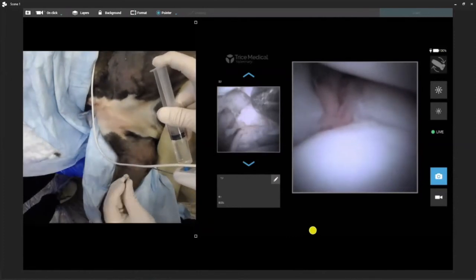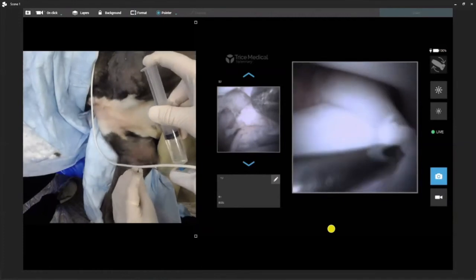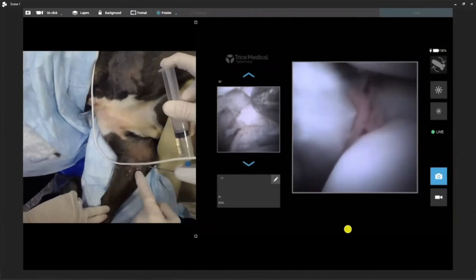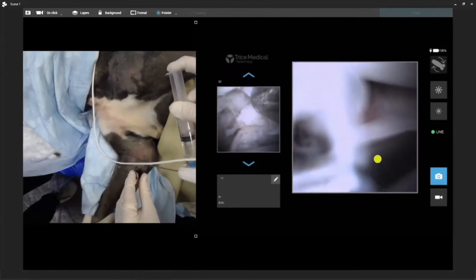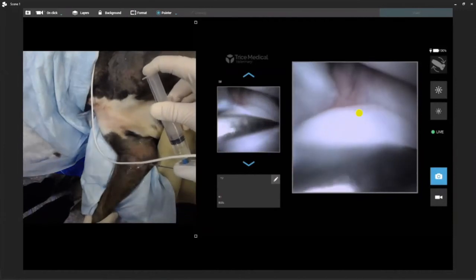We can go for the epicondyle portal. We're just going to do basic triangulation. We can go ahead and slide our needle in. So look at our portal — epicondyle lateral portal. You can see this is going to be our needle. This is exactly where we're going to be going for our treatment or PRP delivery. We can easily see this. We can get our videos and pictures. Let's go ahead and make a portal.